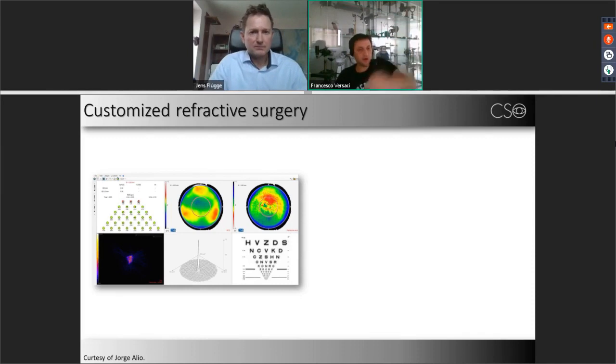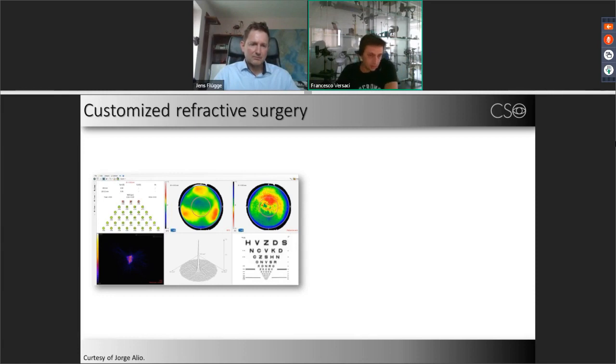So the light from a star. So if the light is going to be very small, my Strehl ratio, that is the way of measuring the quality of a PSF, is going to be high. If I have some aberration and the quality of the vision is not that good, my Strehl ratio is going to be low and the PSF is going to be spread. So in this case was not enough because the PSF was still bad.